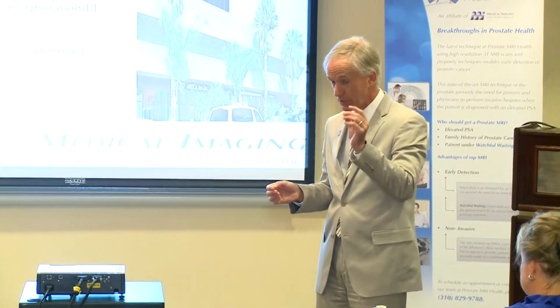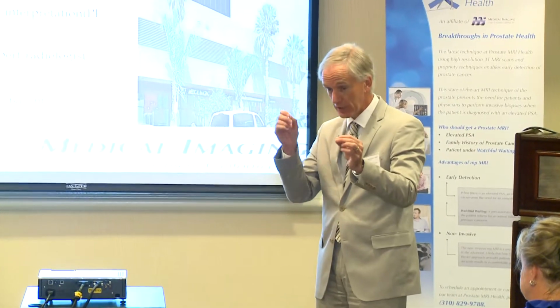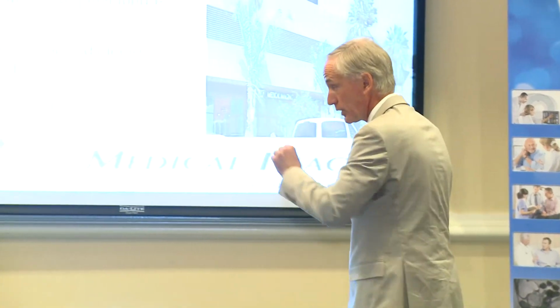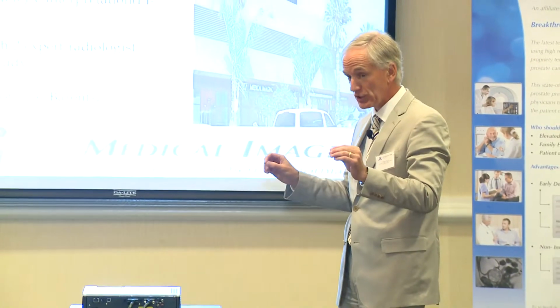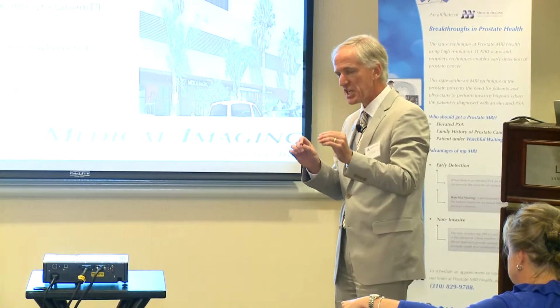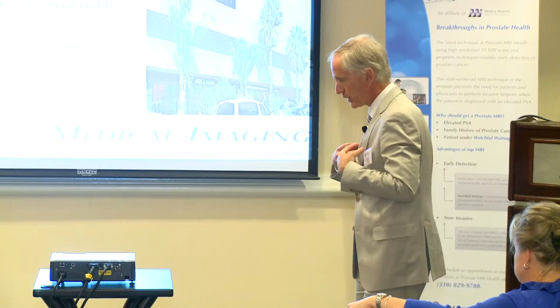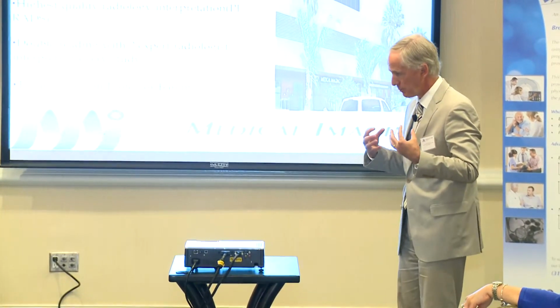However, if something changes into the wrong direction, you should hit the tumor with a very precise needle, either with direct MR bore biopsy or with MR fusion. So you need a biopsy when the MR changes. The chance that you will develop a significant cancer on MRI which is missed is extremely low. So if I would be on the active surveillance, hopefully I will not, then I would choose for MR imaging.